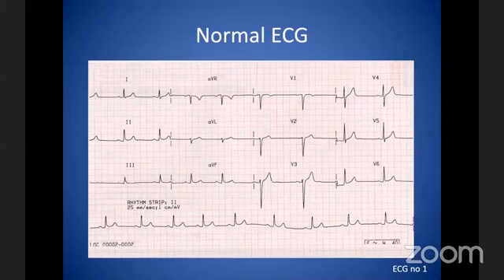Rhythm. Okay, rhythm. Axis. What else? Regularity. ECG settings and label. Good. Make sure it's properly labeled as the right patient. What else? Intervals. Yeah, so PR intervals, QT intervals. Whether it's sinus or not. Yeah, so that's rhythm. Anything else?